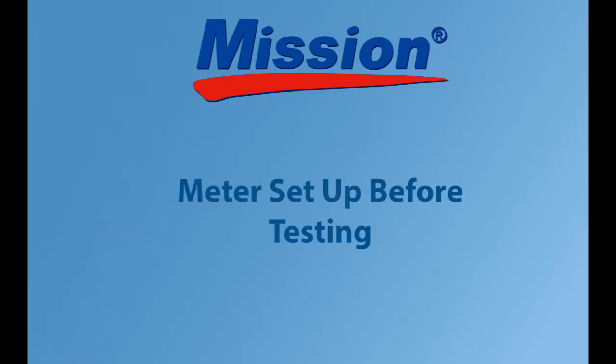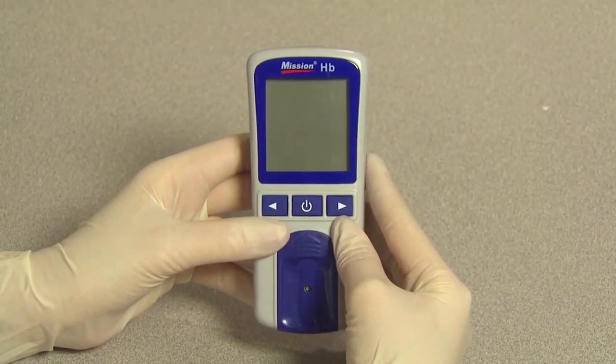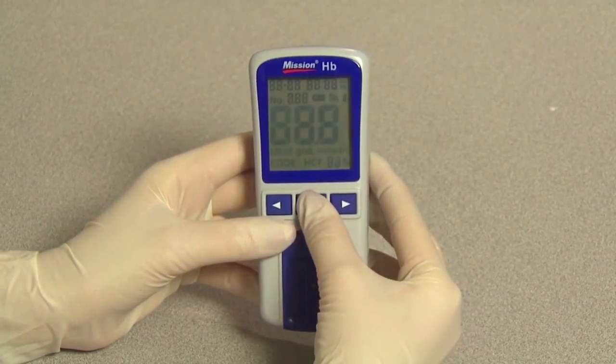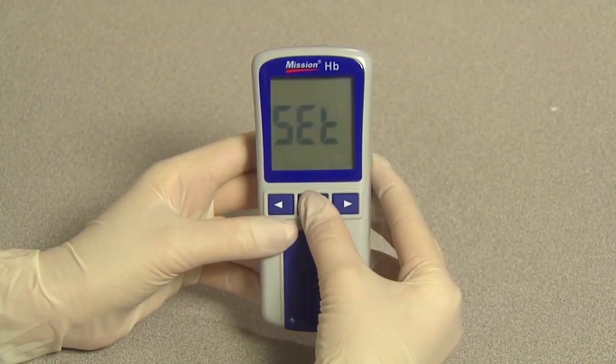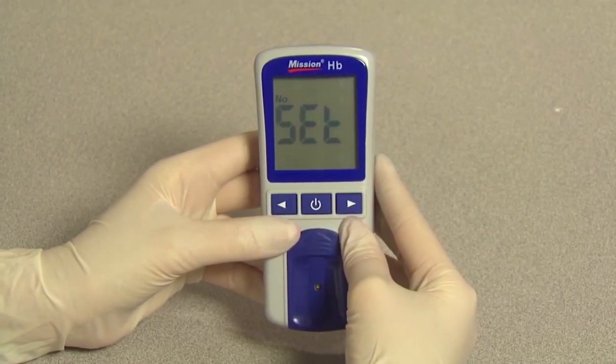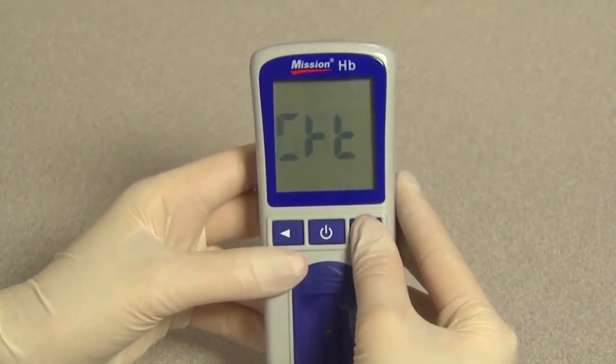Meter setup before testing. To begin initial setup, press and hold the power button for 4 seconds after inserting the code chip to enter the meter setup mode. The test number setup screen will appear first. You can navigate between the different setup submodes by pressing right or left.